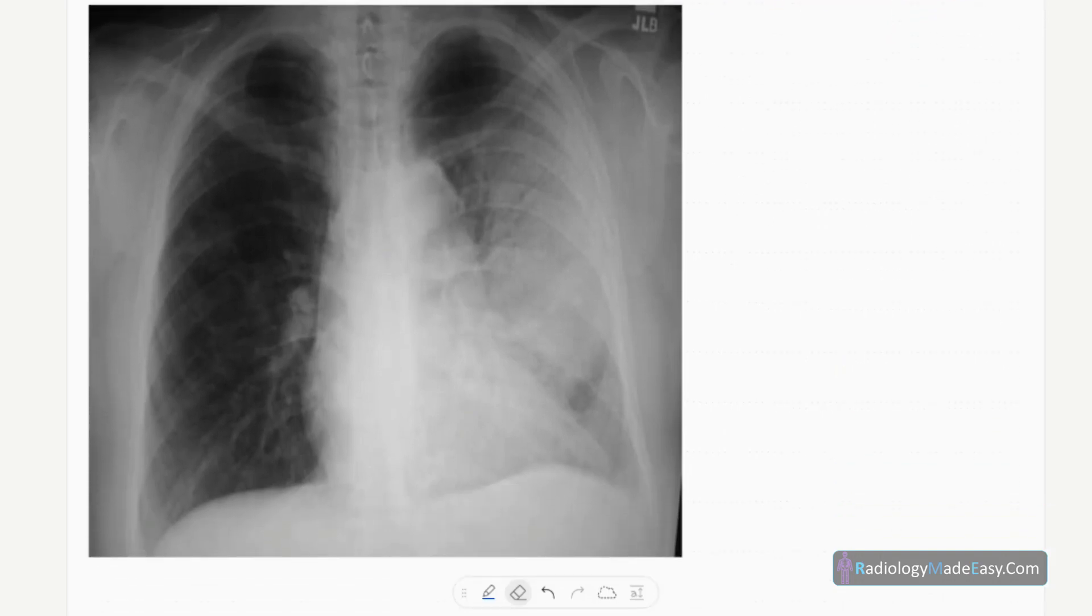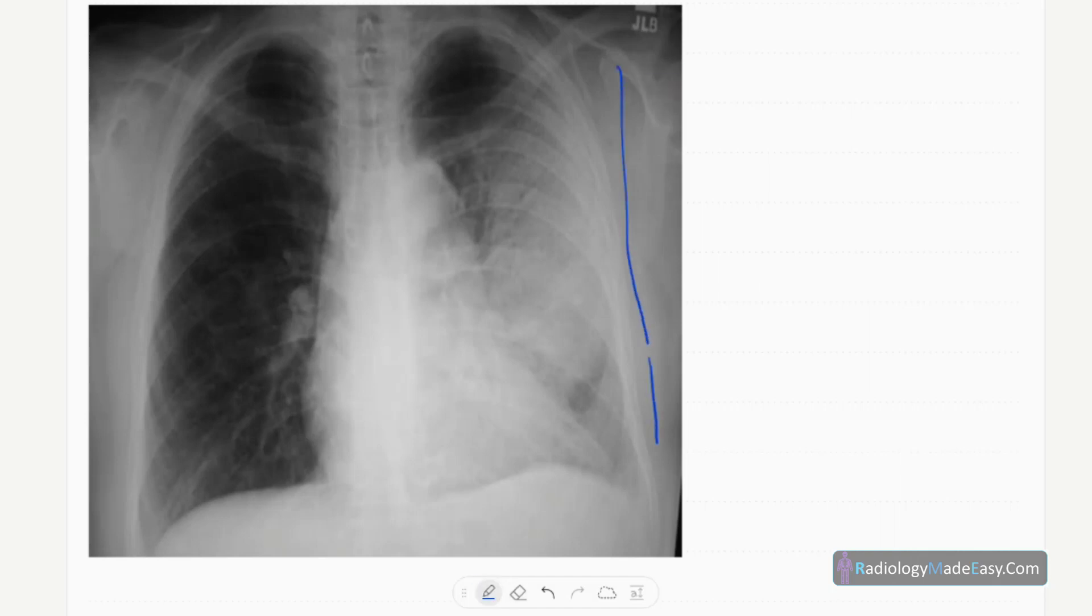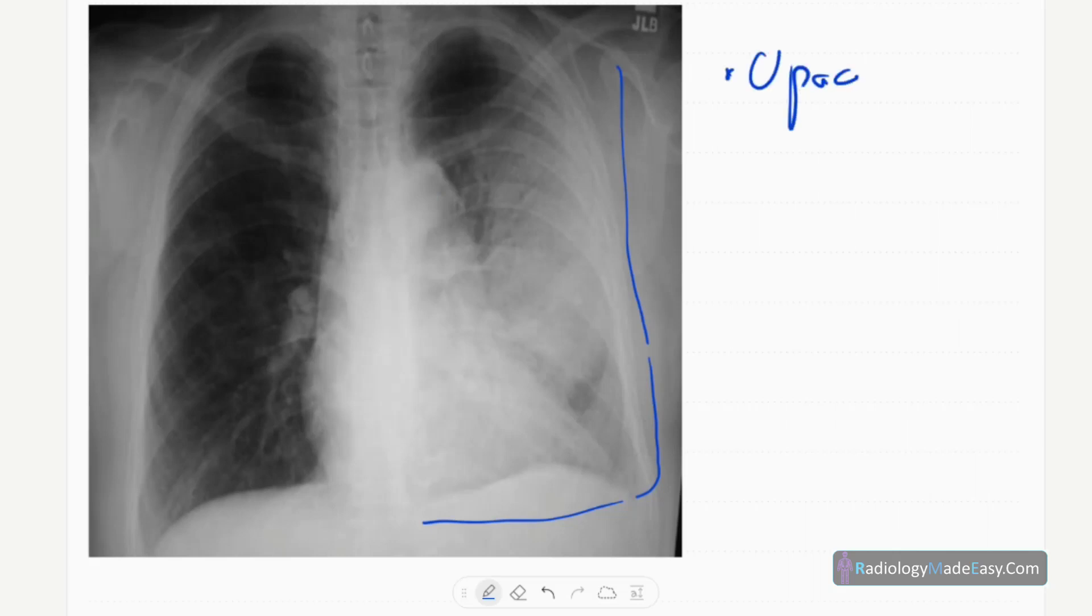The obvious abnormalities are on the left side. You can see inhomogeneous opacification over the left mid and lower zones.